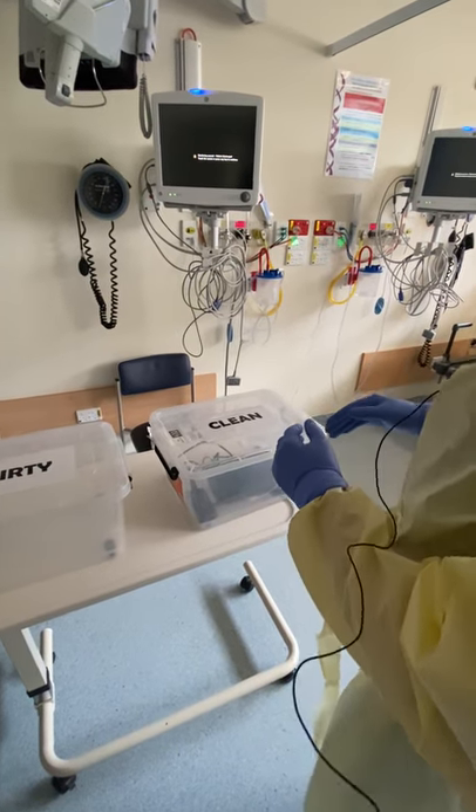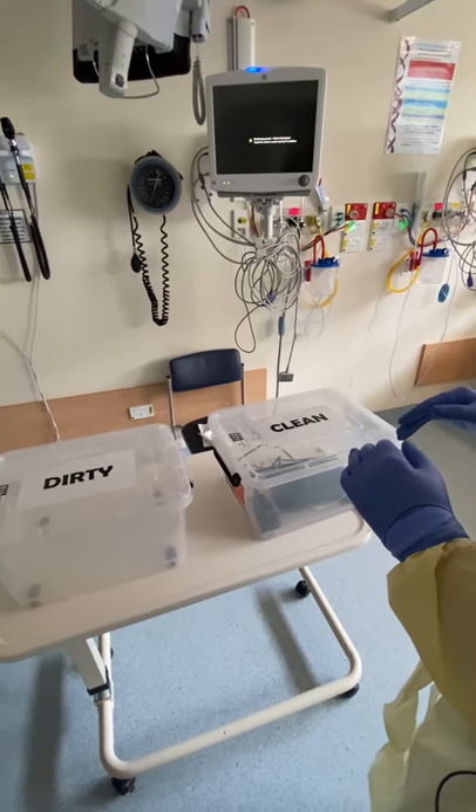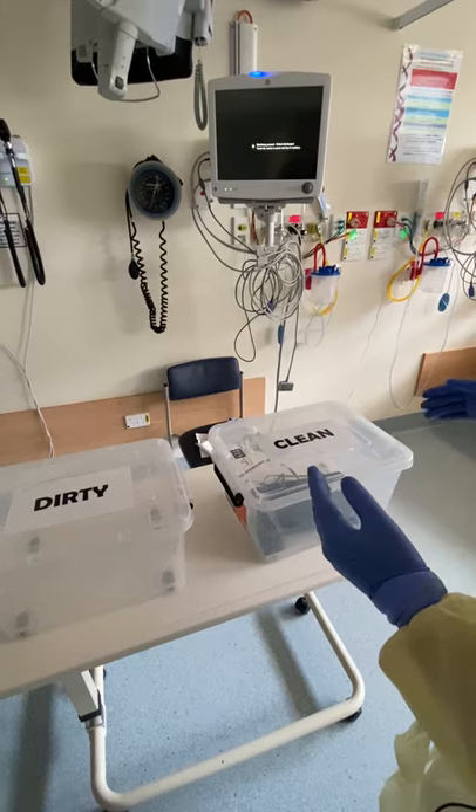I'm going to introduce you to the workflow for using the iViz machine in terms of a lung assessment in a potentially contaminated area.